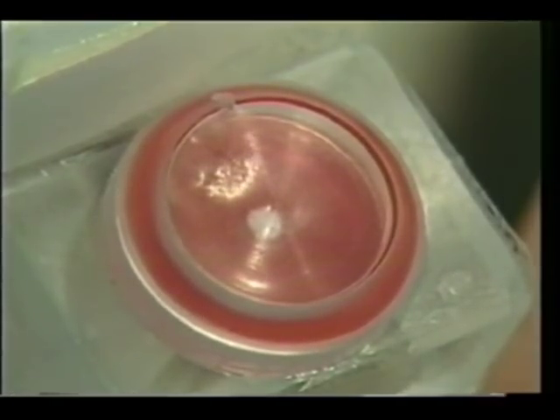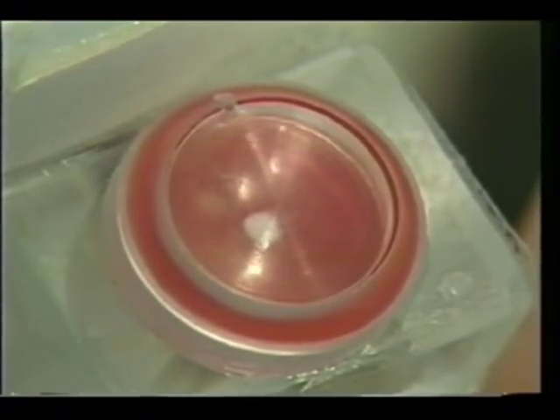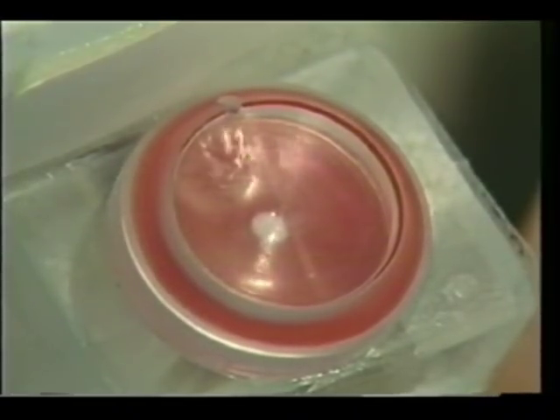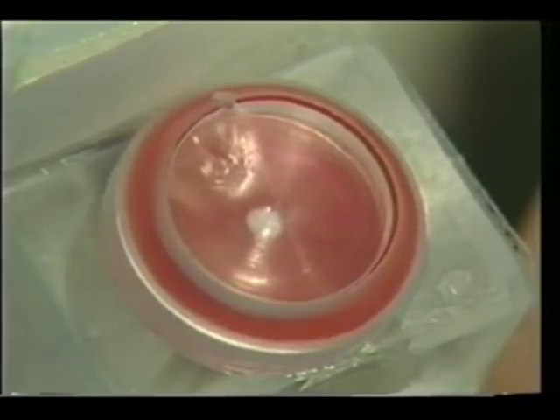When the trocar tip perforates the pleural membrane and enters the pleural cavity, the red signal diaphragm deflects upward, indicating a pressure in the pleural cavity greater than plus 2 mmHg, and deflects downward, indicating a pleural cavity pressure of less than minus 2 mmHg. The signal diaphragm continues to fluctuate until the pneumothorax is resolved.